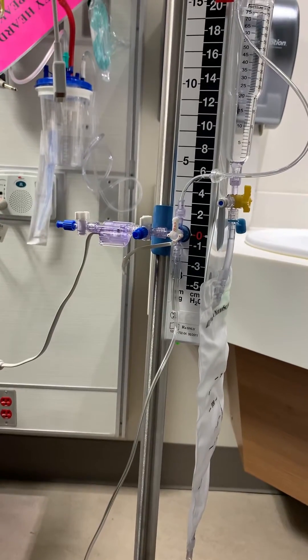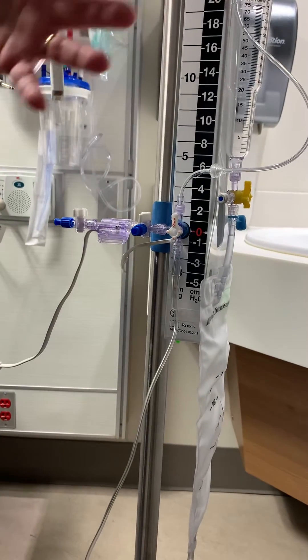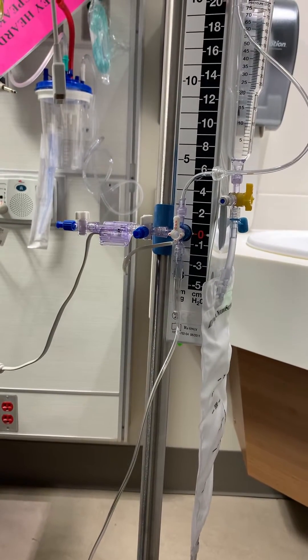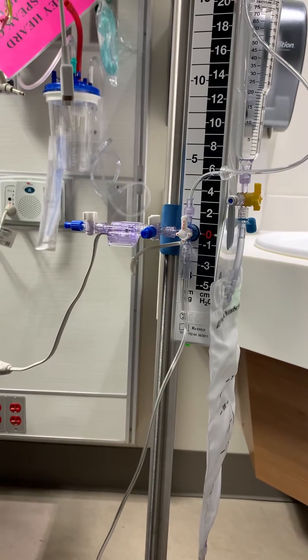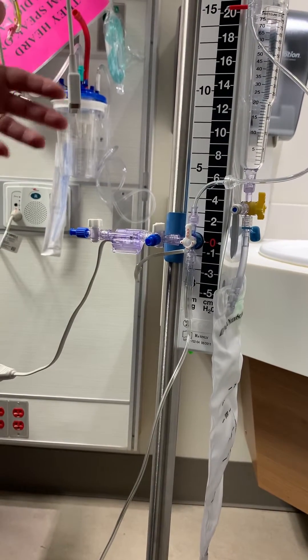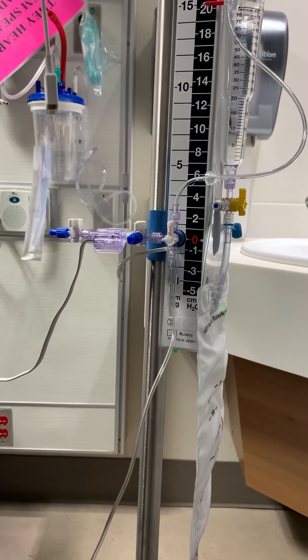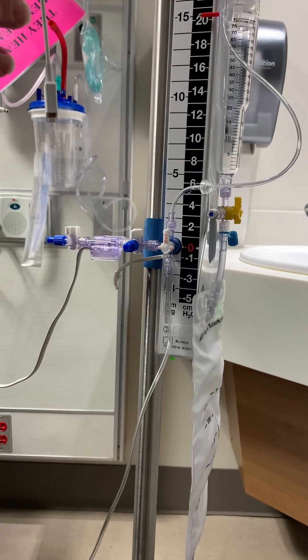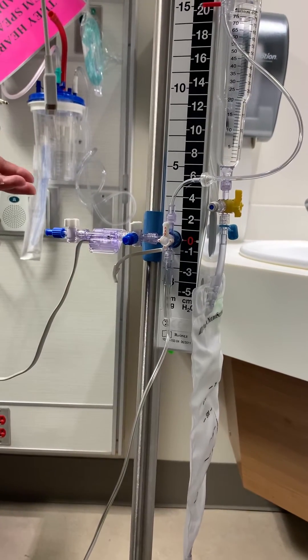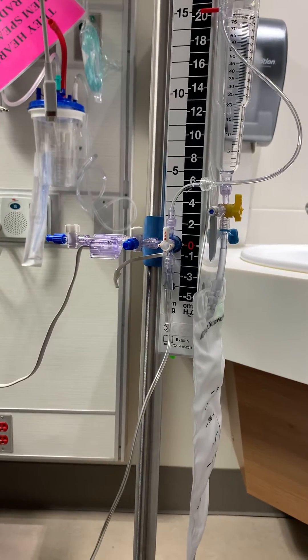For the purpose of zeroing, we want to make sure that we get rid of any atmospheric pressures so that when we are trying to get an ICP, we're getting an accurate ICP that doesn't have any influence from anything else. We want to do this at the beginning of your shift, at your tour of duty, and really unless you've questioned your numbers or you've had to disconnect your tubing or whatever, you really only need to do this once in your shift.